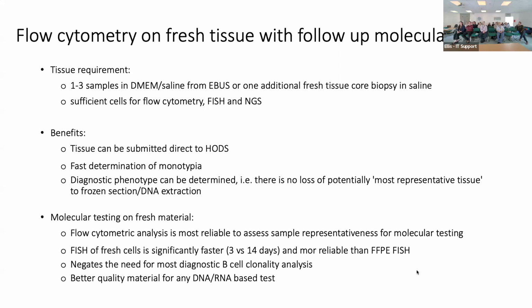By the time you receive the sample, you've done all your investigation in the flow sample, and you've sent it already off for the molecular testing. So it's already running. In some cases, you already get results back by the time you get your first H&E to look at and make your mind up what you want to do with it. And again, how much tissue you need for this, we don't yet know, but we're keeping an eye on it.